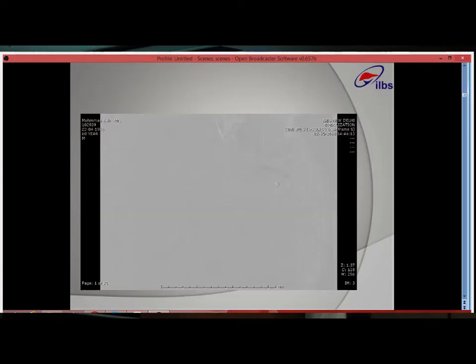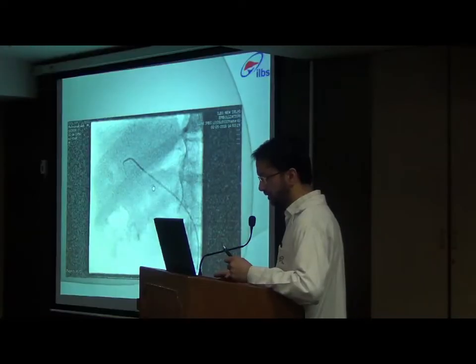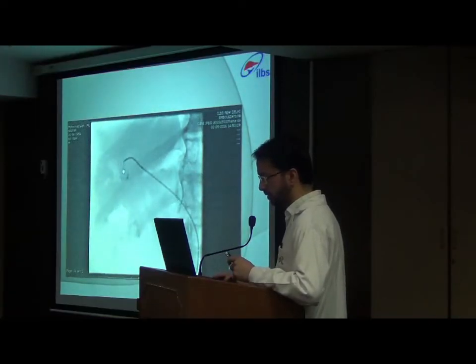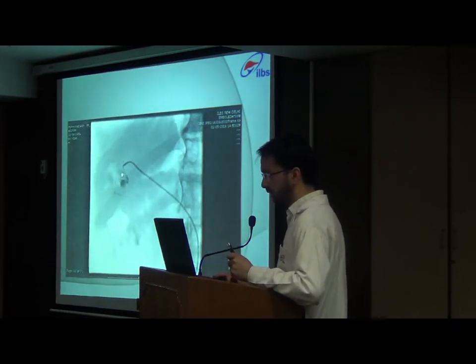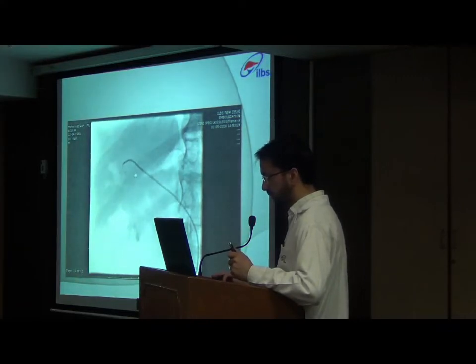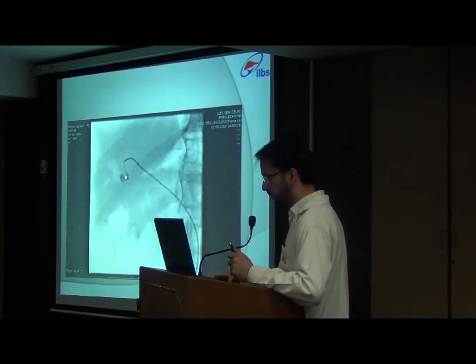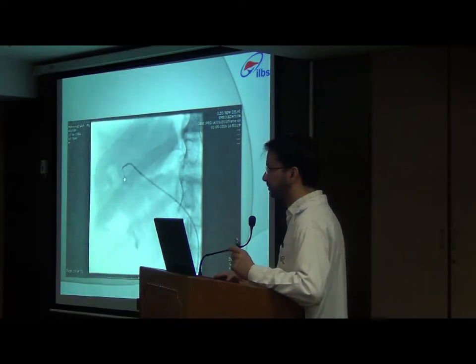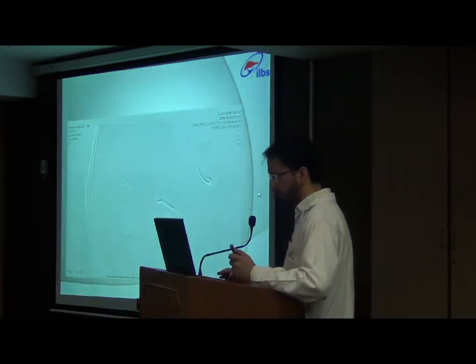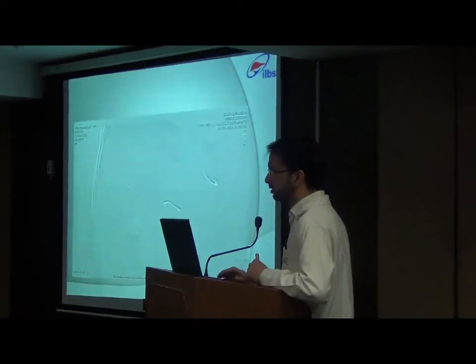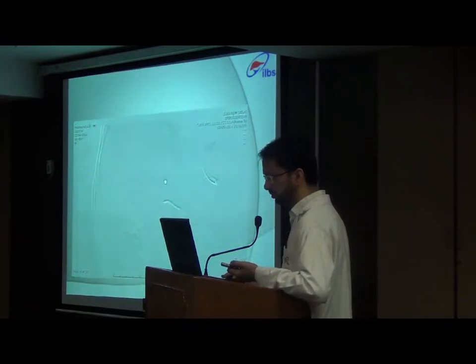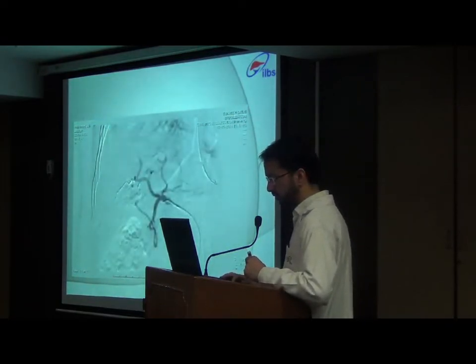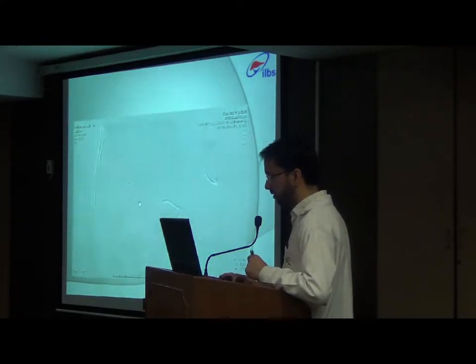This is the super-selective cannulation of the cystic artery. We can see the very narrow caliber microcatheter passing into the cystic artery system and the pseudoaneurysm is filling. We can compare it with the rib size or the vertebral body height to imagine how narrow the catheter is. Glue was injected into the pseudoaneurysm and on the post-procedure run we can see that the cast of the glue confirms the pseudoaneurysm has been completely knocked off.